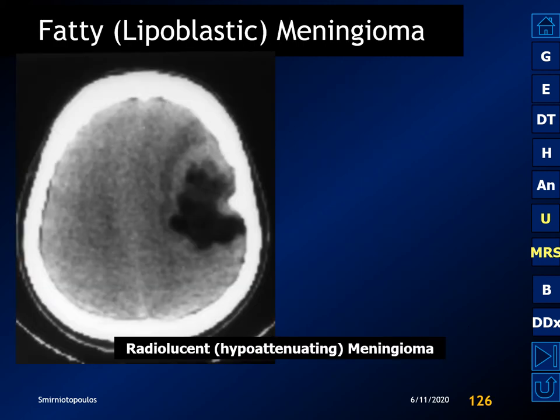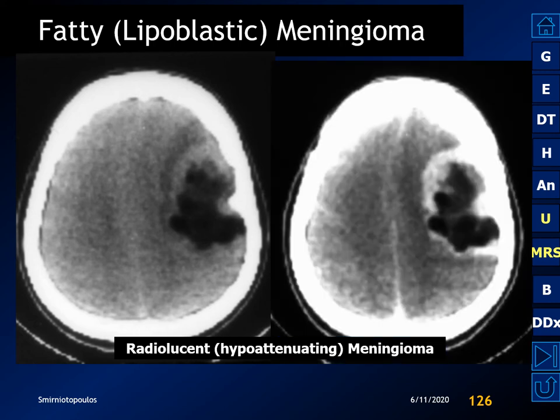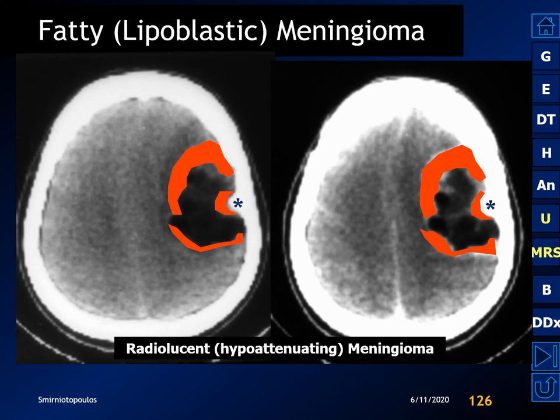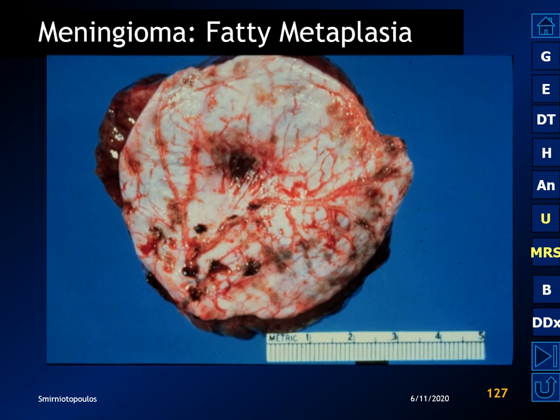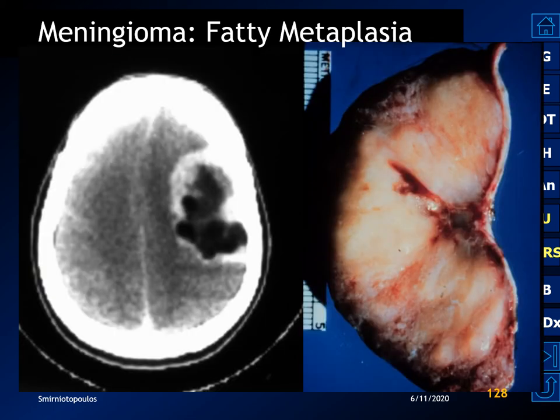Here's a classic example of fatty metaplasia or a lipoblastic meningioma: an abnormally low-attenuating hemispheric mass with a peripheral rim of hyperattenuation, with parts of the tumor showing the expected attenuation of a meningioma and hyperostosis. The presence of hyperostosis is key in identifying this as a meningioma. The gross specimen shows the yellowish color of fat instead of the meaty color of a typical meningioma, with a meaty part of the tumor adjacent to the hyperostosis.